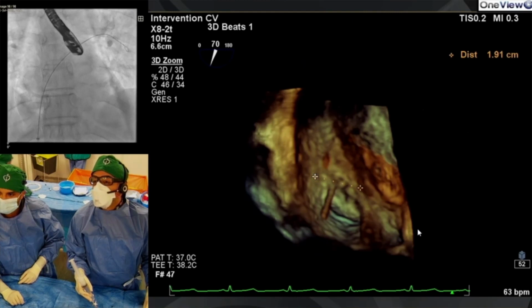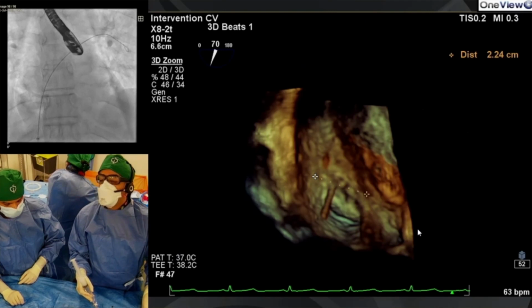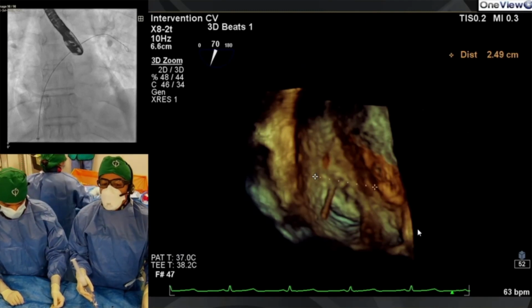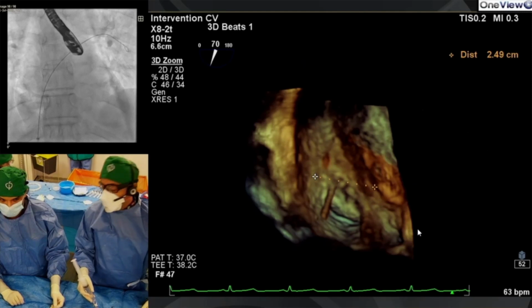And if it's too big, your disc, because obviously you need a bigger one, you're saying, to cover the big RA opening, actually you'll sit on the aorta and on this ridge, and then it'll display the PFO open. So that's why I'm worried that this actually is the strategy. I mean, depending how the balloon looks, the strategy is better to plug the hole rather than close the flap.